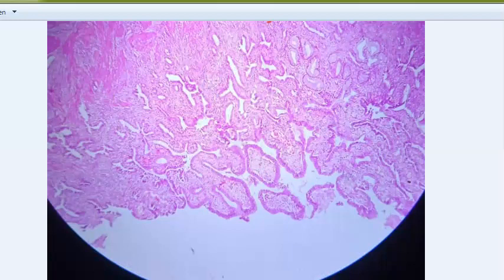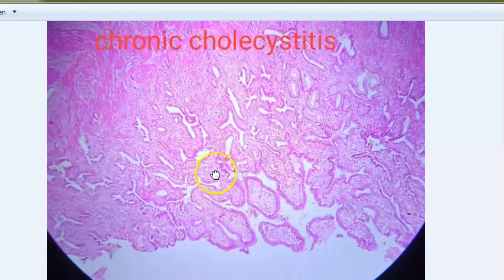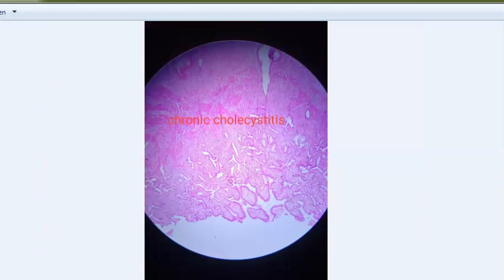You can see mucosa lined by tall columnar epithelium, mononuclear inflammatory cells, hypertrophied muscularis layer, and Rokitansky-Aschoff sinuses - deep sinuses penetrating into the wall. This is chronic cholecystitis. Inflammation of the gallbladder involves penetration of mucosa deep into the wall up to the muscularis layer to form Rokitansky-Aschoff sinuses. Chronic inflammatory cells are seen in the lamina propria with variable fibrosis of the perimuscular layer. It is usually associated with gallstones.